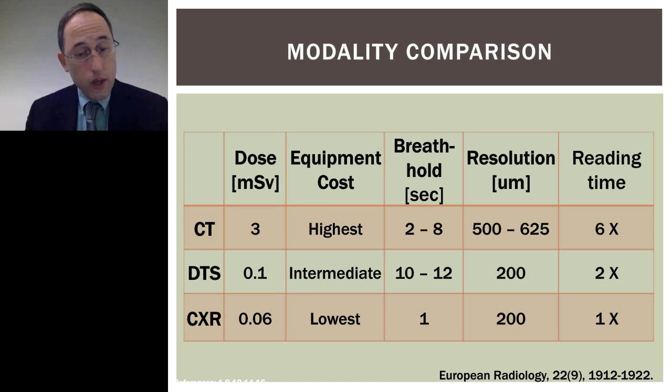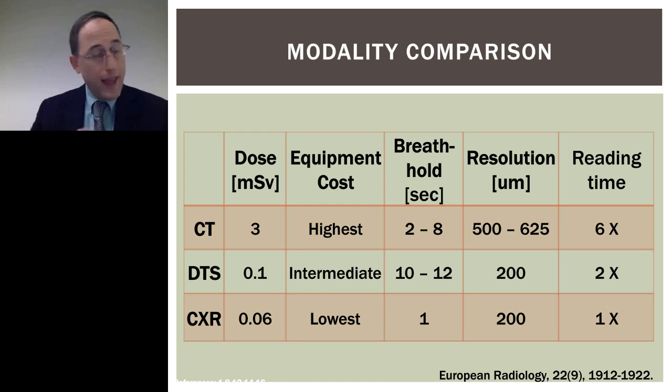And I don't know when things like that will be incorporated into clinical systems, but I do know that people have used them and they exist. So that is not a hard stop for tomosynthesis. Its dose can also go down using the same dose reduction techniques that you see in CT.